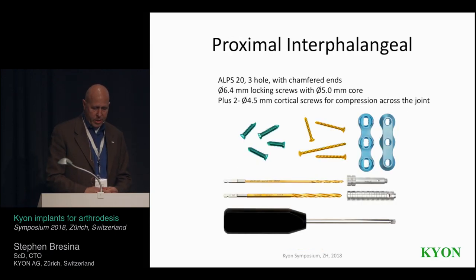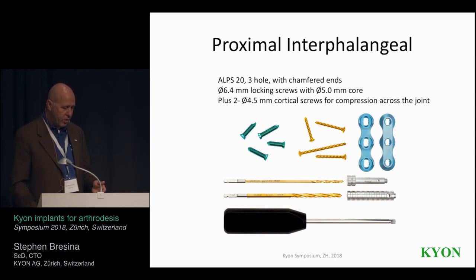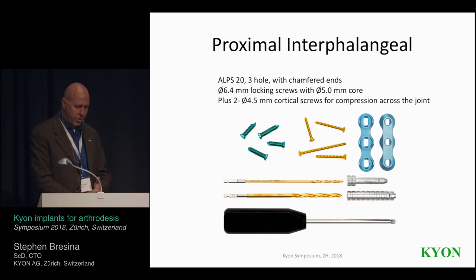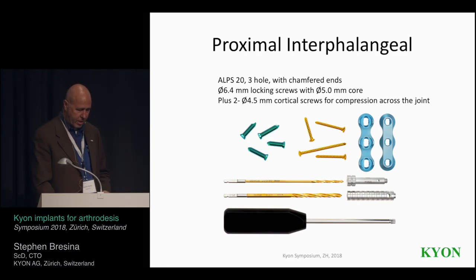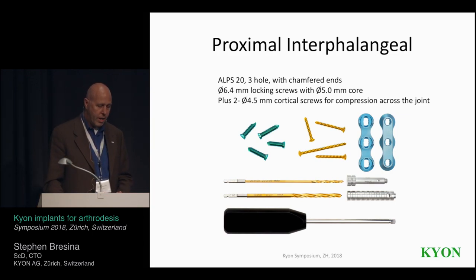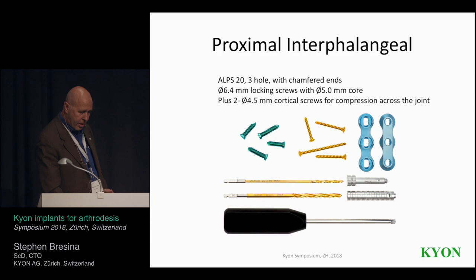Okay, then the last one is the one that we have for equine use. This is the proximal interphalangeal plate. It's just a 3-hole plate. For the horse, this needs a big screw. This is a large 6.4 diameter locking screw. This is a big thing. The screwdriver that you use for that, if you look at the normal Torx 10 size that we use on normal screws, this uses a Torx 30 screwdriver. And in conjunction with the plate, you use a couple 4.5 cortical screws to go across the joint.